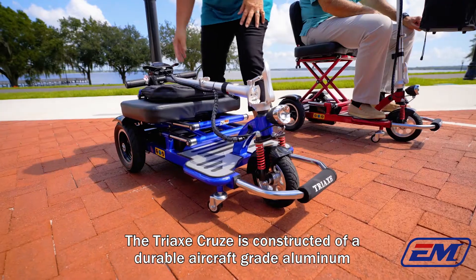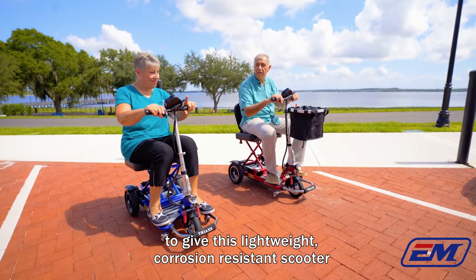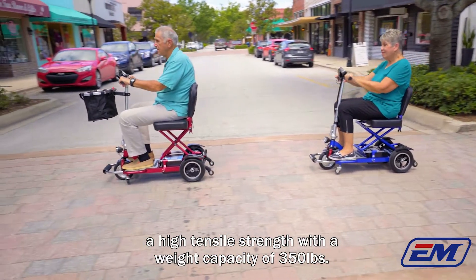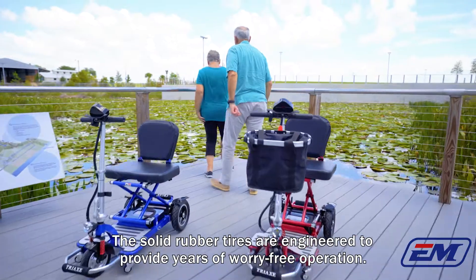The Triaxe Cruze is constructed of durable aircraft-grade aluminum to give this lightweight, corrosion-resistant scooter a high tensile strength with a weight capacity of 350 pounds. The solid rubber tires are engineered to provide years of worry-free operation.